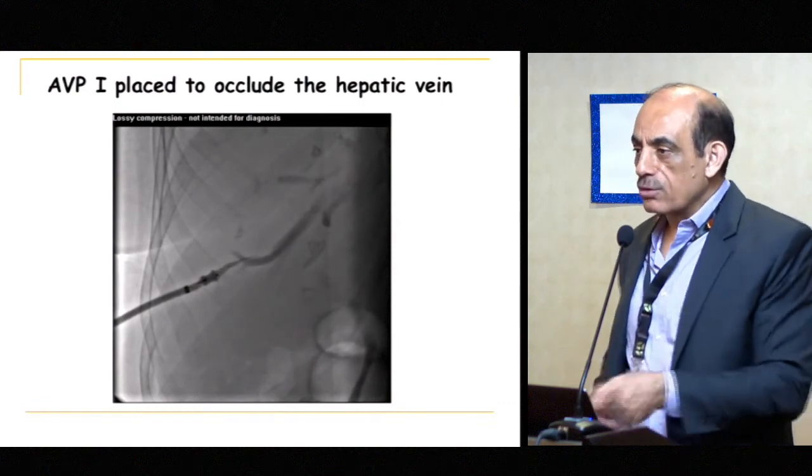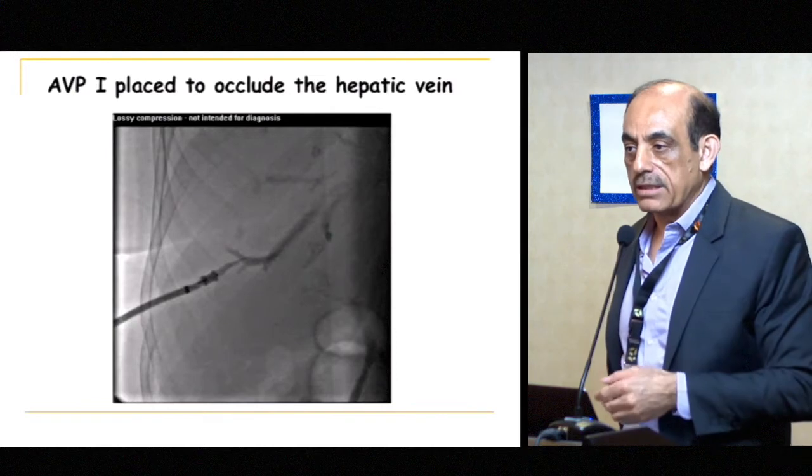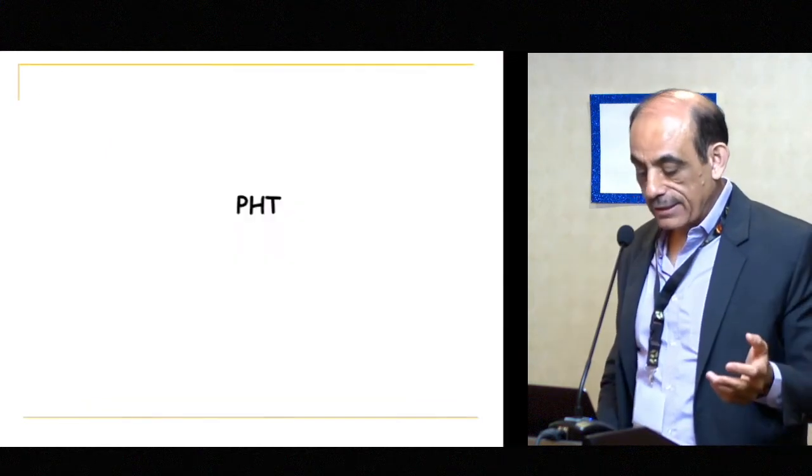And then almost always I use it. A lot of people don't use it. I always put a coil or an AVP1 or AVP2 or something like that to close it.